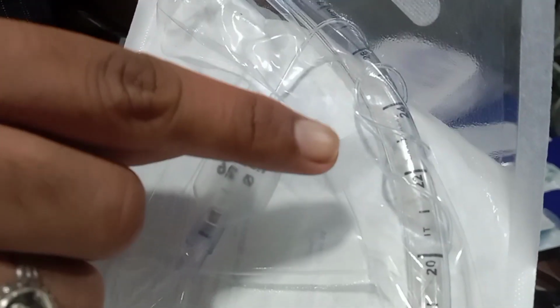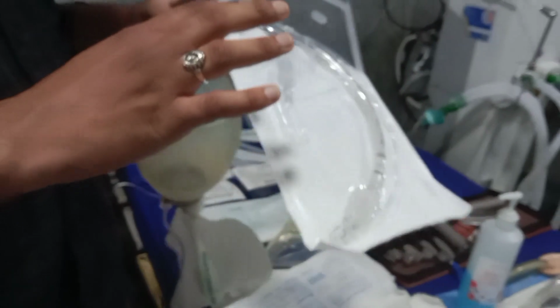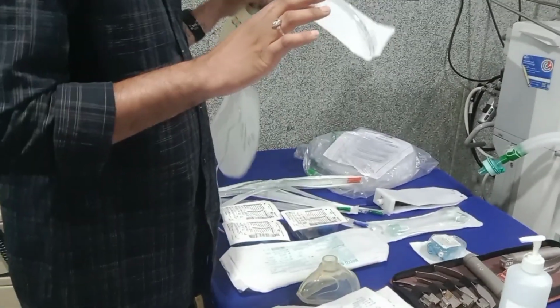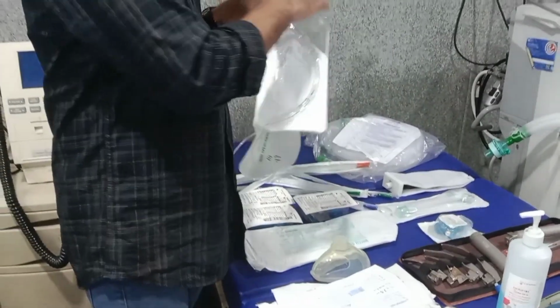Based on the markings, wherever you feel the airway is clear, you can fix the tube. Generally, we do it at 19 to 22 or 20, wherever the airway is clear. When you make sure that bilateral air entry is clear and even, you can fix the tube.